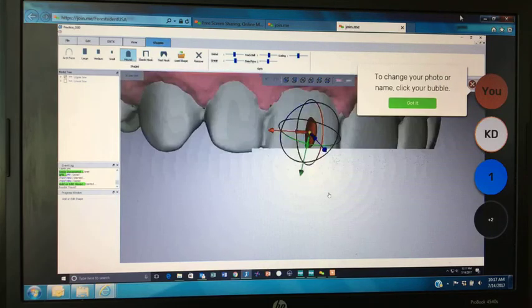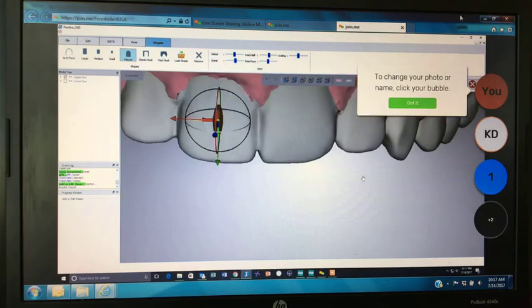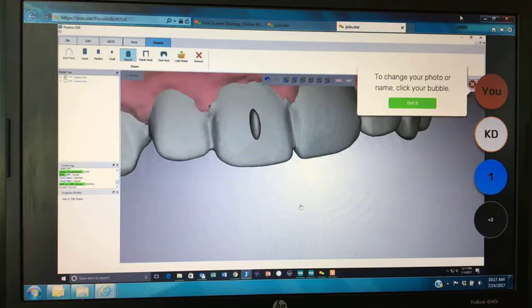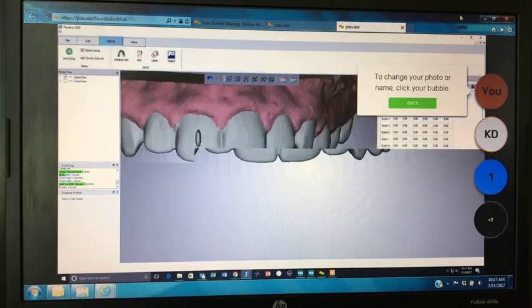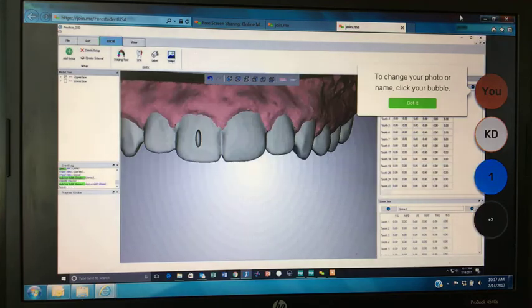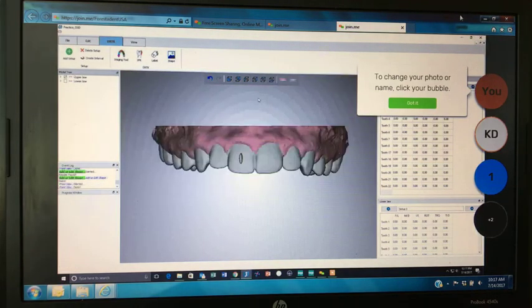If you want to look at this attachment without this gyroscope, go ahead and double click in the gray area, and that's going to let you look at that attachment on its own. Now once I hit OK, since I did this in setup 0, the software is going to add it to all your other ones. So I can arrow through all through setup 8, and the software's already populated that for you.